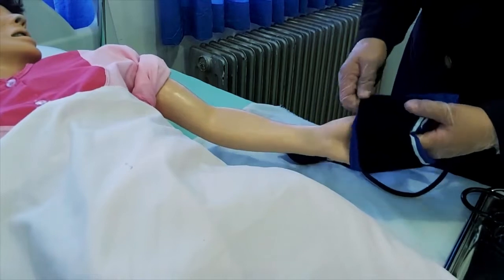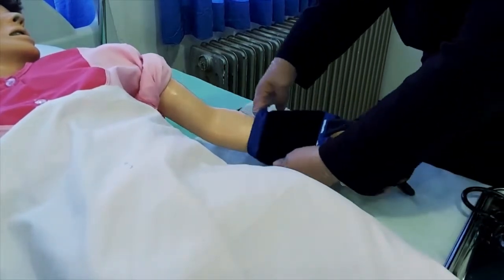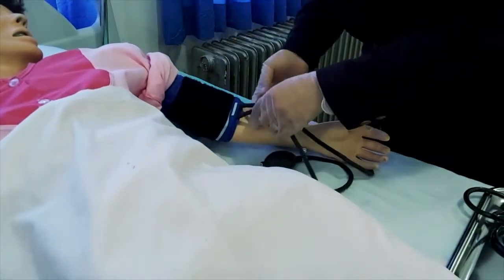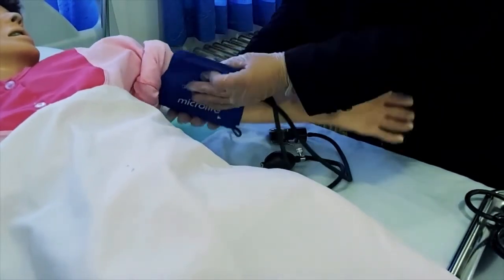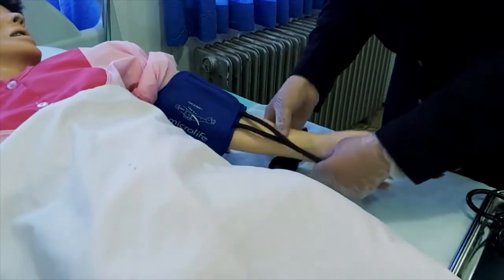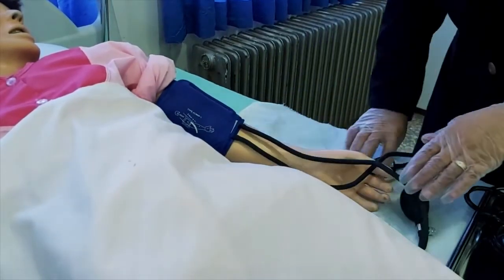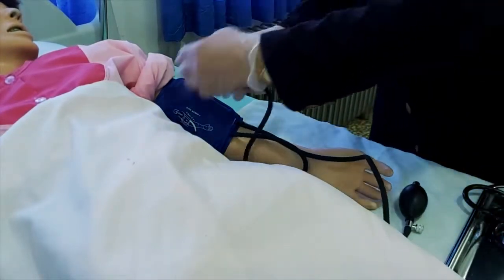کاف را طوری می‌بندیم که به اندازه دو و نیم سانتیمتر بالاتر از نبض براکیال که در چین آرنج قرار دارد، باشد؛ به نحوی که به اندازه یک انگشت جای حرکت داشته باشد. لوله‌های لاستیکی خارج‌شده از کاف هم در امتداد ناحیه مرکزی چین بازو باشد.